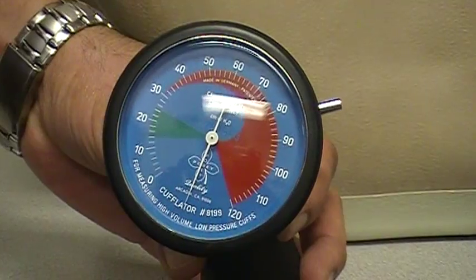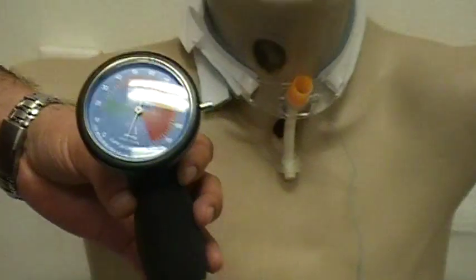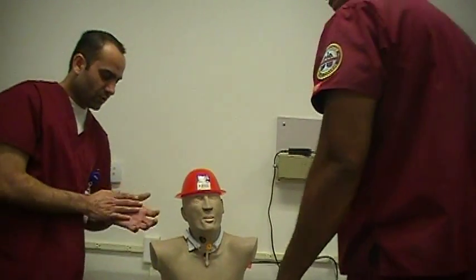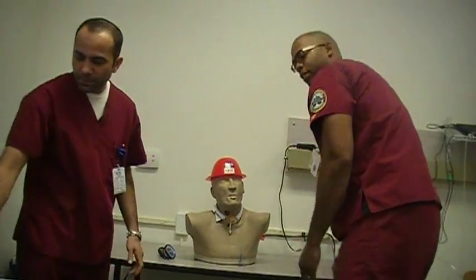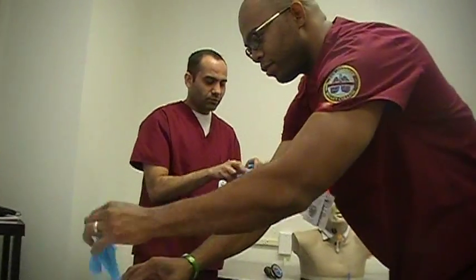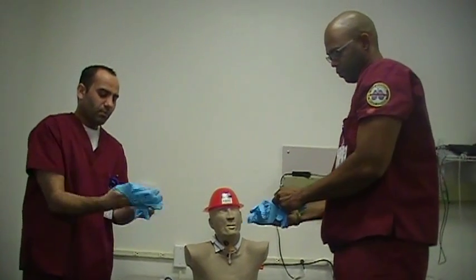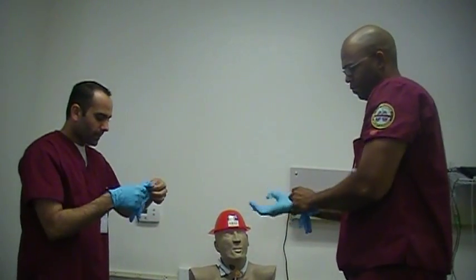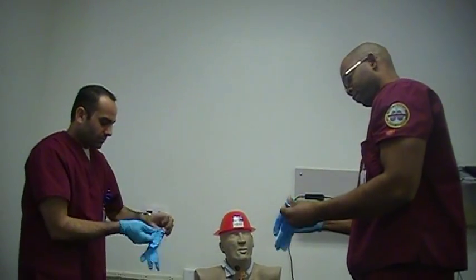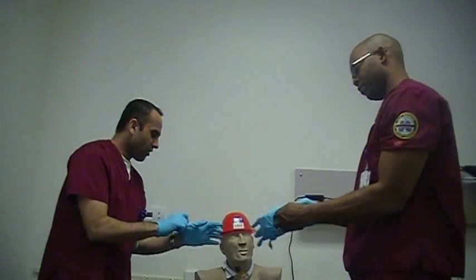The procedure we'll do — we'll show right now what we're going to do. First, go ahead and do the asepsis. We're just going to wash our hands, make sure everything is all nice and clean. I don't have my gloves on — put our gloves on. All right, we're ready.